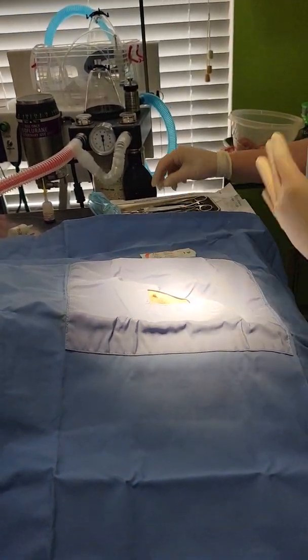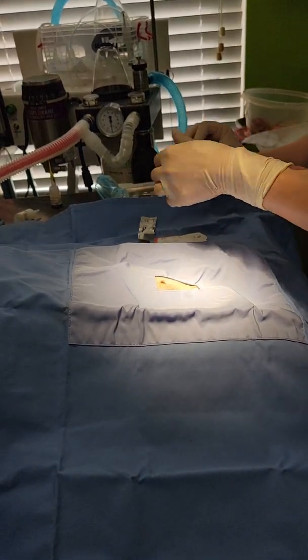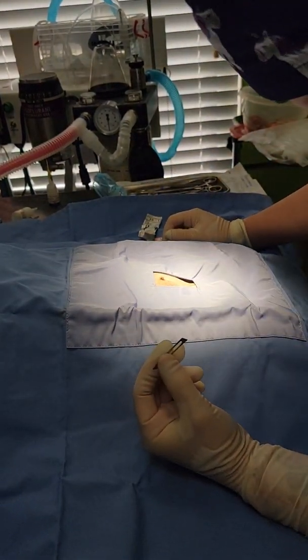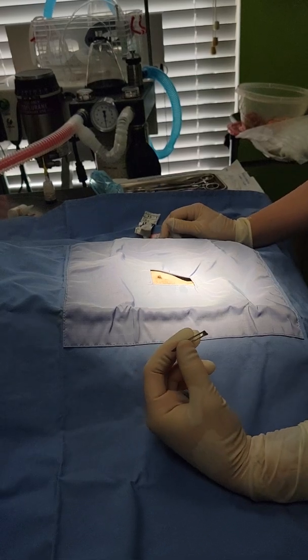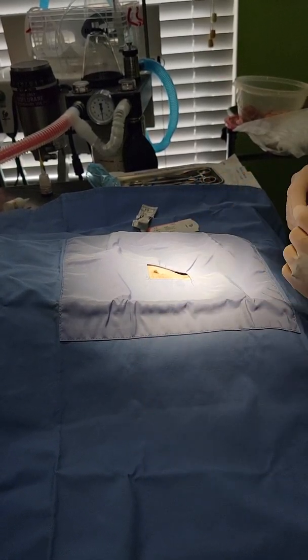So what we've done before already: we've pre-medicated with midazolam and buprenorphine. He's on inhaled isoflurane. We've shaved, we've prepped. We've also done a local lidocaine block with 0.1 mls on either side of our incision.